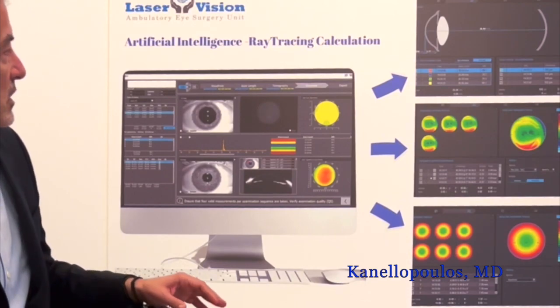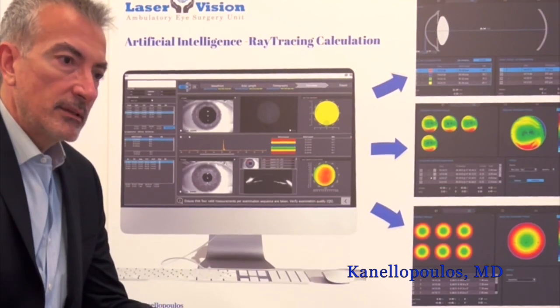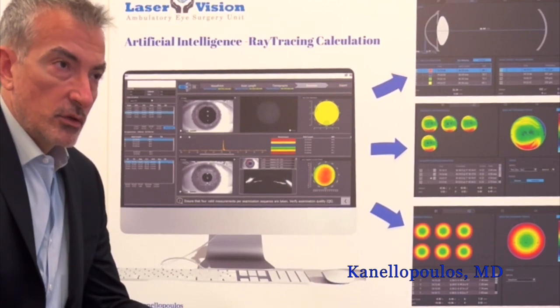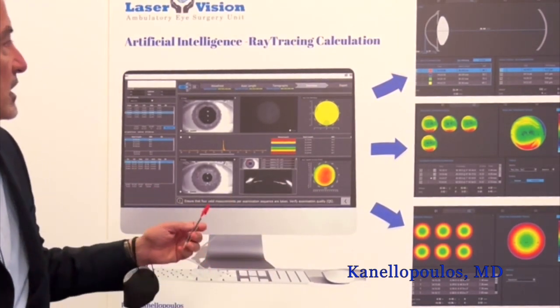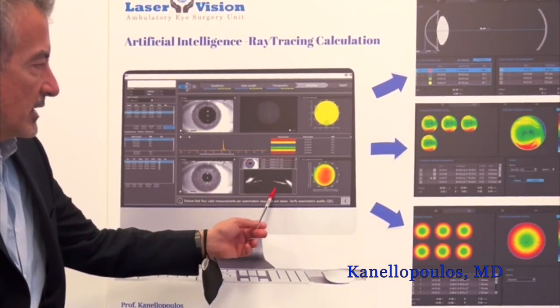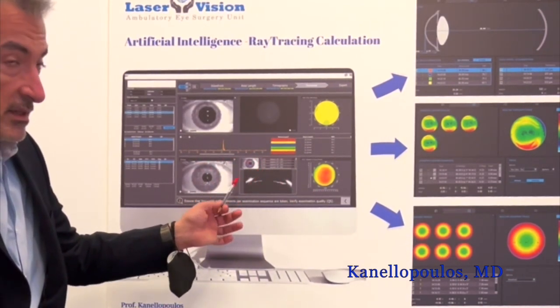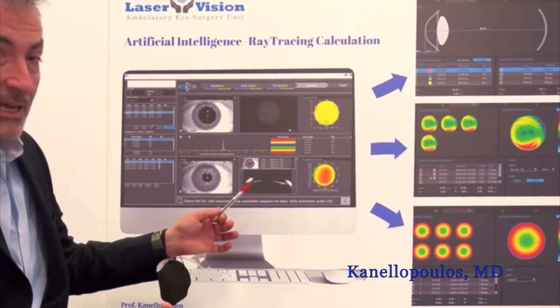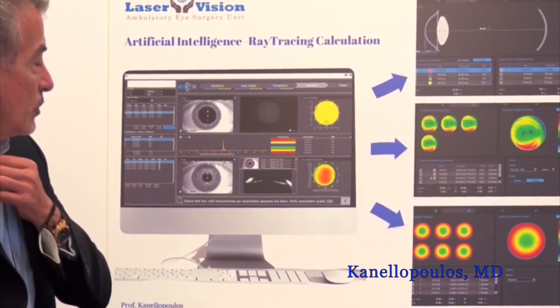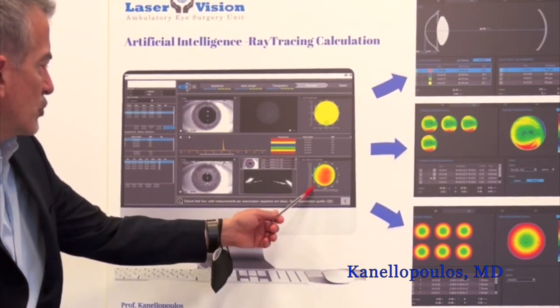And in essence, it all starts with a diagnostic device, which is an adapted Oculus Pentacam HR AXL wave. So it's a single device that's able to give us three different measurements. It can give us a high resolution Pentacam, and we can see it here. This is the display from the device, which in Alcon language is called the SiteMap. So the SiteMap, after we're measuring a human eye, can give us Pentacam HR measurements.